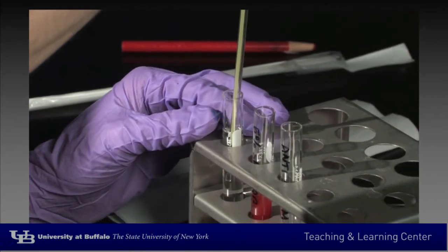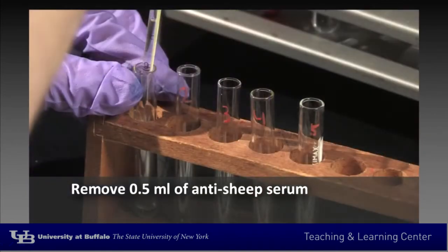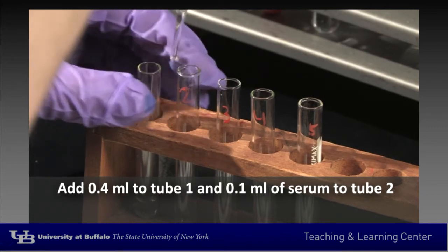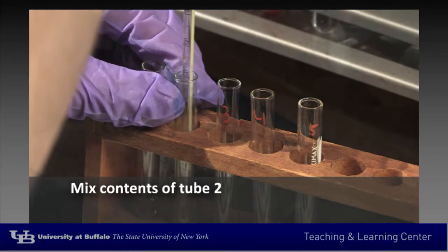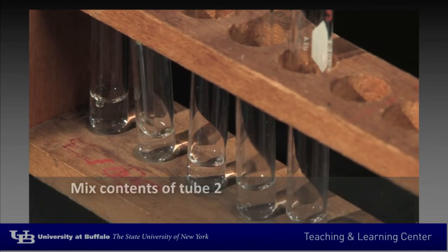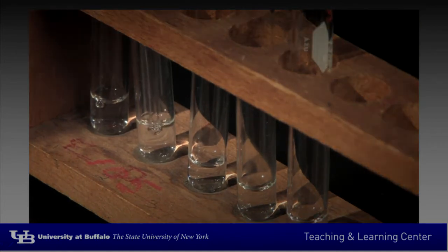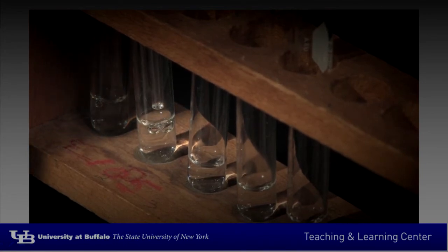With a separate 1 ml pipette, remove 0.5 ml of anti-sheep serum and add 0.4 ml to tube number 1 and 0.1 ml of serum to tube number 2. Mix the contents of tube number 2 thoroughly by drawing up and dispensing out the contents a few times. You want to make sure you mix well the contents of the tube, which contains 0.1 ml of anti-serum and 0.4 ml of saline.